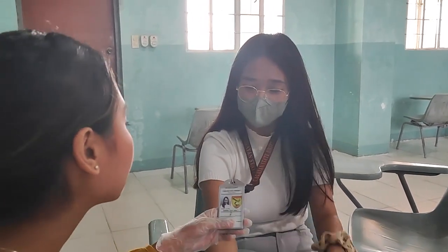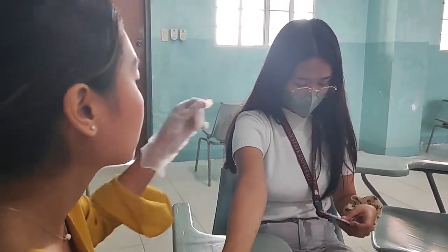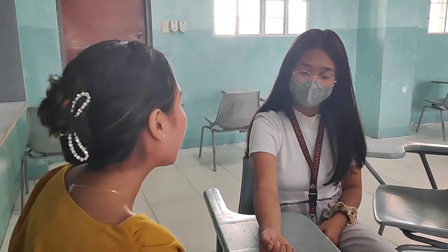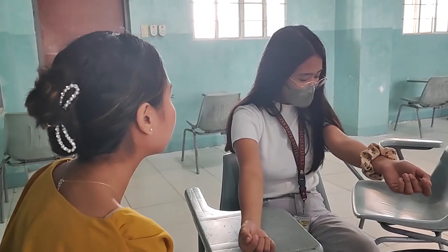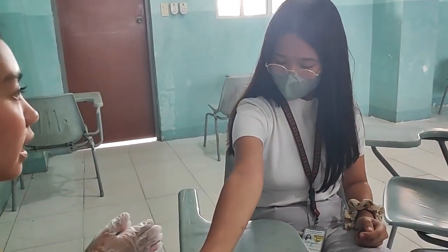Sir, kumusta po kayo? Maaari ko po bang malaman kung meron ba kayong dalang ID? Meron po. Okay po. So ngayon po, magpe-perform po ako ng ETS po sa inyo. So, maaari ko po bang malaman kung saan po kayo madalas kinukuhanan ng dugo? Actually, both po sila po. Pero dito. So, mag-i-start na ako. Wala po ba?